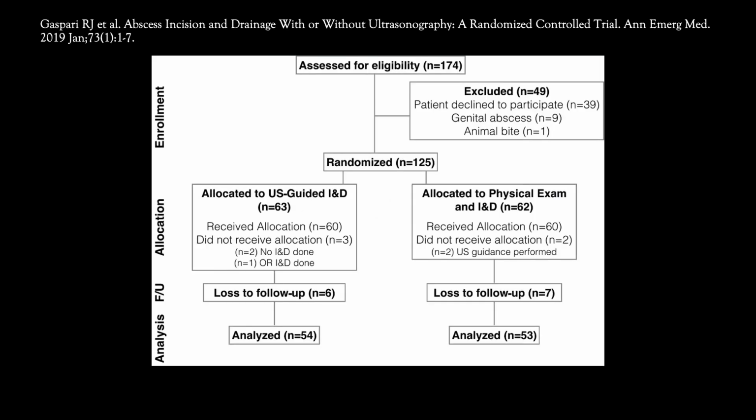Another useful study by Gaspari et al. is a randomized controlled trial that looked at outcomes of abscess I&Ds in patients who received and did not receive point-of-care ultrasounds. Stable patients who presented to a single site with a suspected skin abscess requiring incision and drainage were eligible. 125 patients were enrolled, in which 13 were lost to follow-up. The remaining 107 patients were followed.